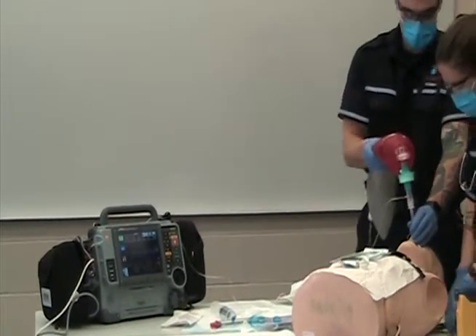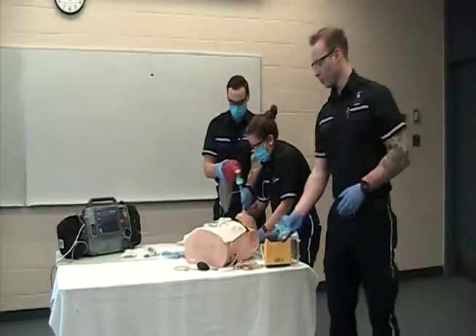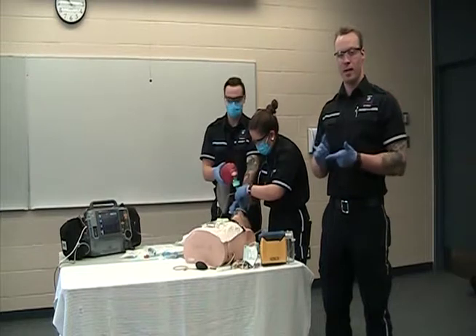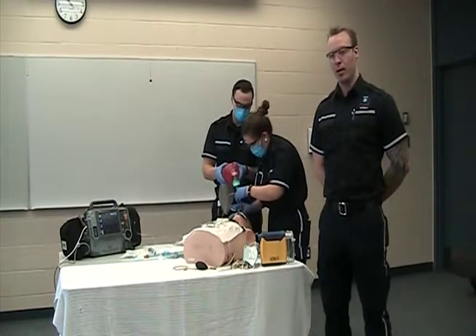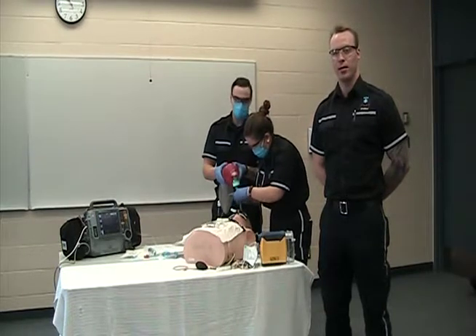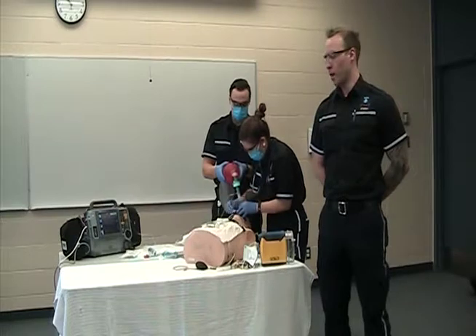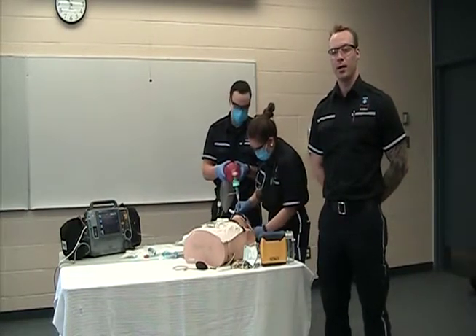So after we've intubated, we want to go through our 6 confirmations. So I visualized the tube going through the vocal cords. Saw misting in the tube. I saw end-tidal waveform on the monitor. We had EDD inflation once we placed it on the ETT. And we heard no breath sounds over the epigastrium, and we had breath sounds bilaterally, left to right.